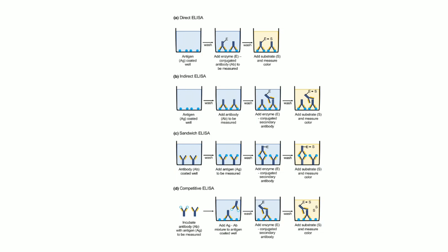So already you have the antigen, then in the patient sera if the antibody was present, this antibody will bind to the antigen coated on the well. Now you are adding anti-human immunoglobulins which are conjugated or tagged with an enzyme. They will go and bind to the antibody.